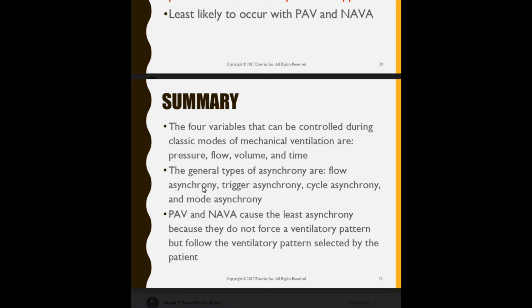Now, the problem is where you will have to fix their tidal volume, and overall their minute ventilation. But I made them comfortable because I didn't over-distend their alveoli. I didn't over-distend their lungs. And now they are somewhat comfortable, but now I just have to work on getting their tidal volume and minute ventilation up there.